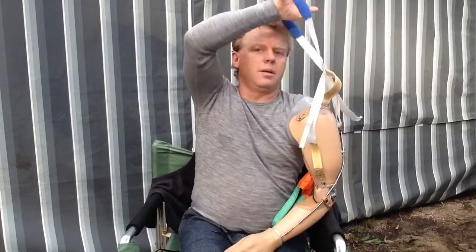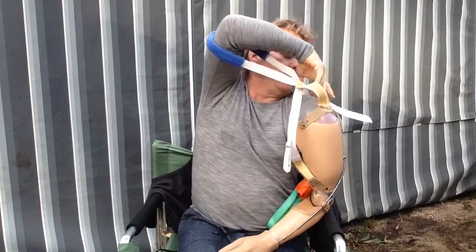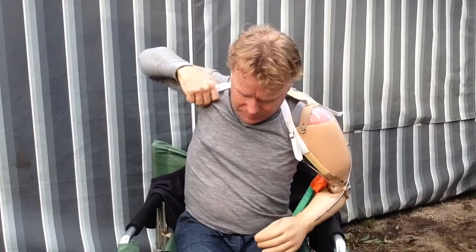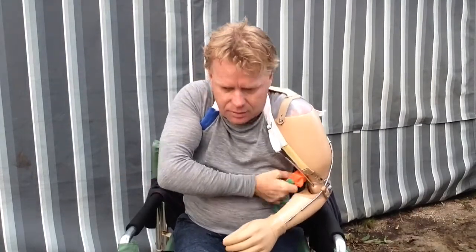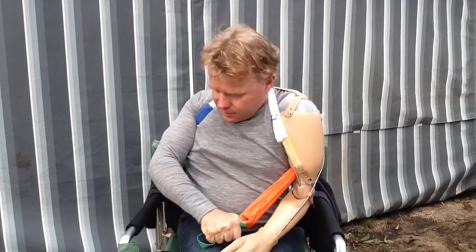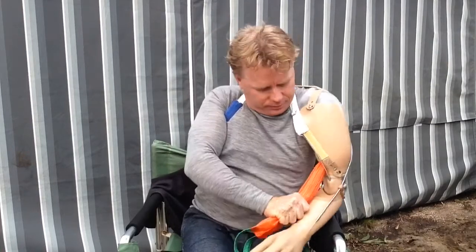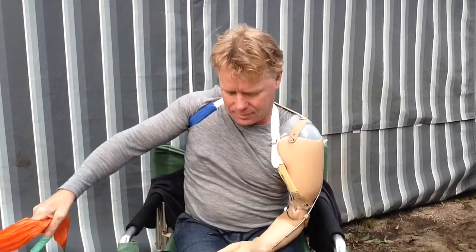Now the next bit is to climb into my harness, which is a really, really strange thing to do. However, I am getting used to it. It still hurts. And now that I've got that far, I've got to pull all of my arm down into the actual socket. Sorry about the facial expressions but it does take a bit of effort.